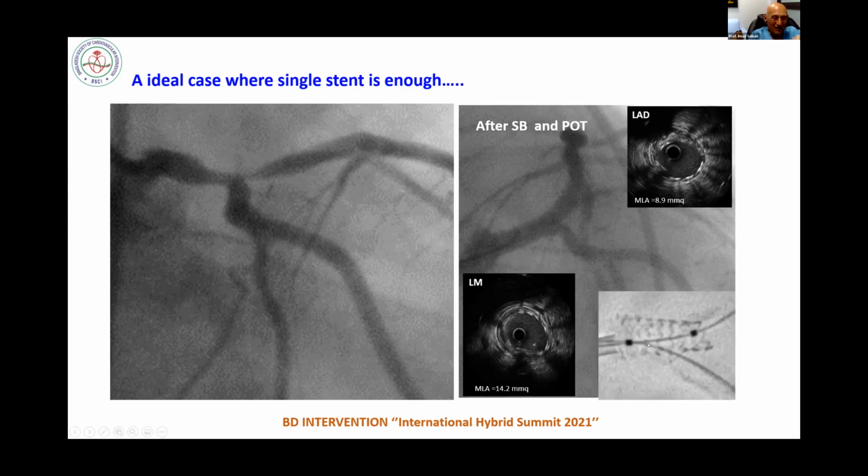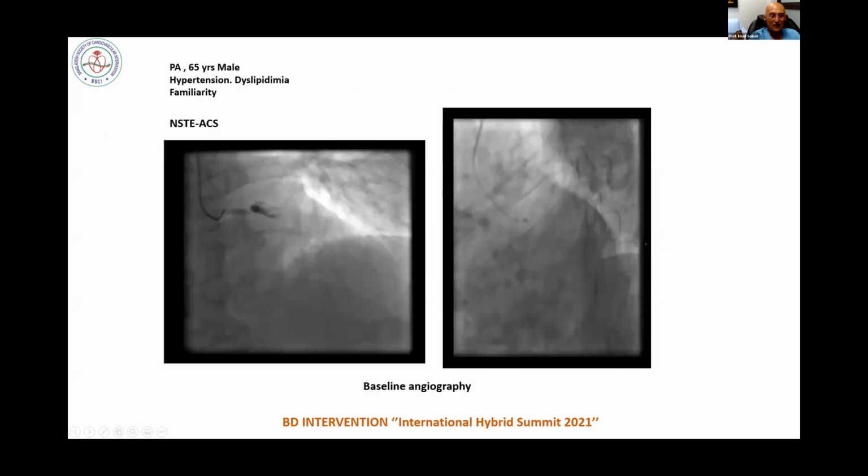And I think also if you look at how we should stent in this situation, you see that the optimization should give good conformability of the stent to the bifurcation in distal left main, like you can see by stent boost in this case.